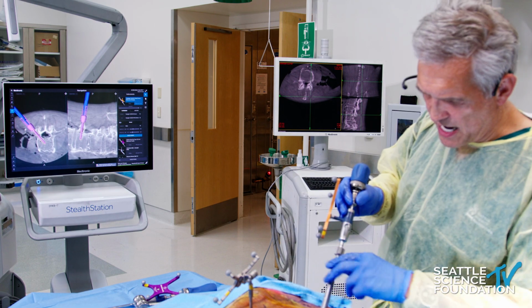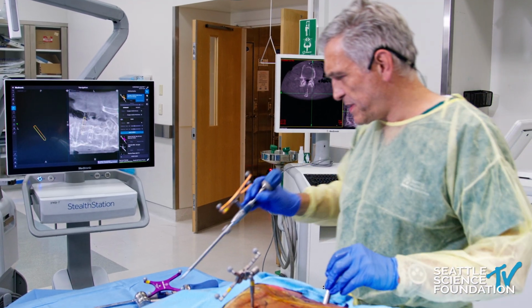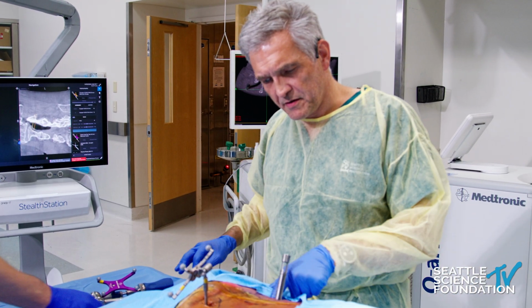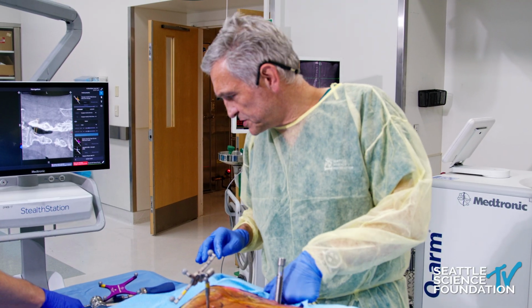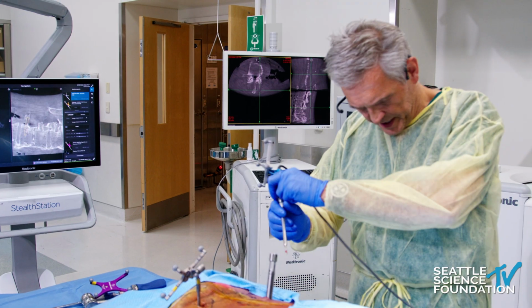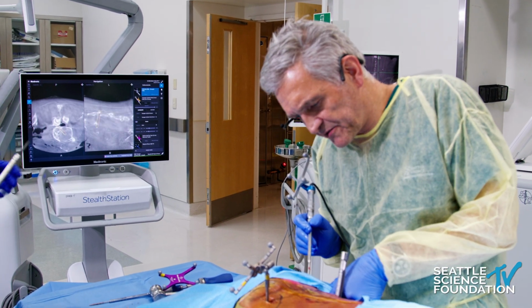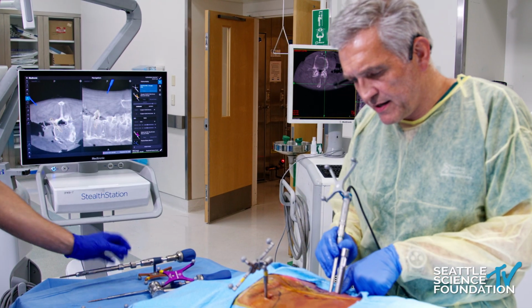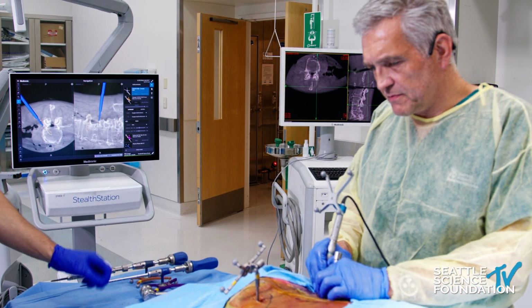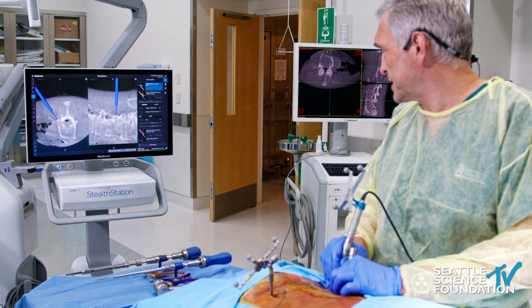All right, so this is now the pedicle screw here. And then should we do the same thing on the other side, at the other level? That was L3, and I always start with the screw that's further away from the reference array because that's theoretically less accurate, right? So you want to do that in the beginning.